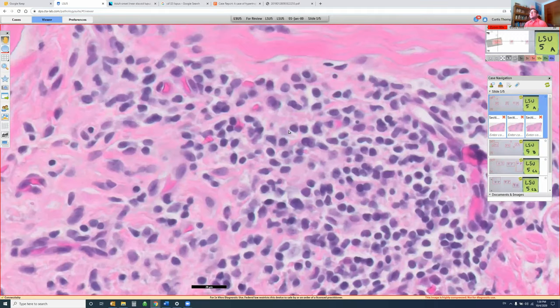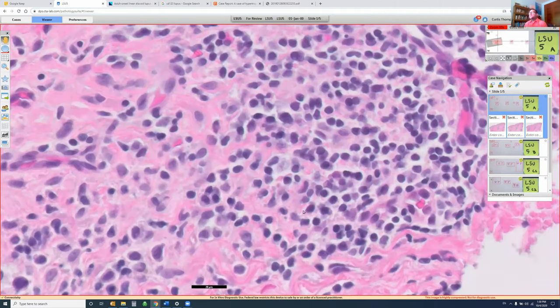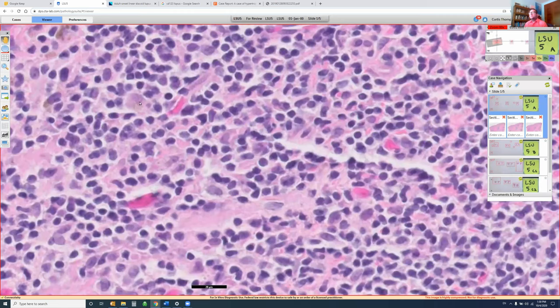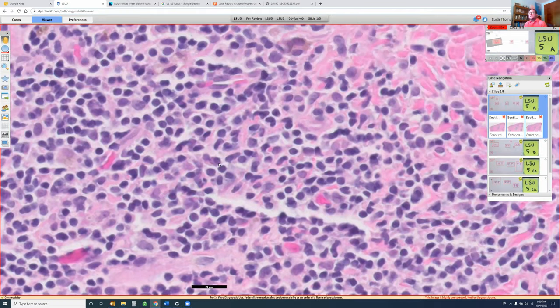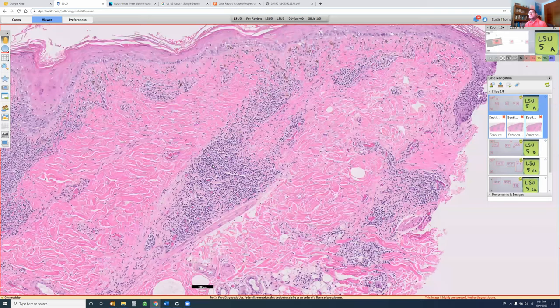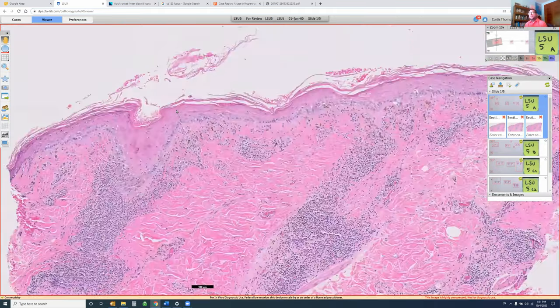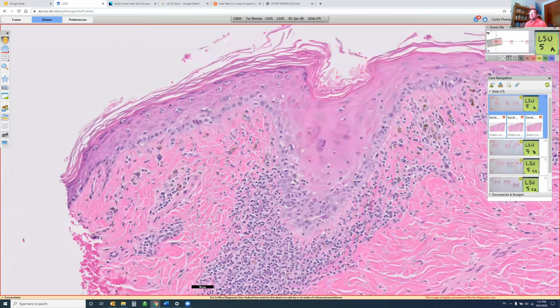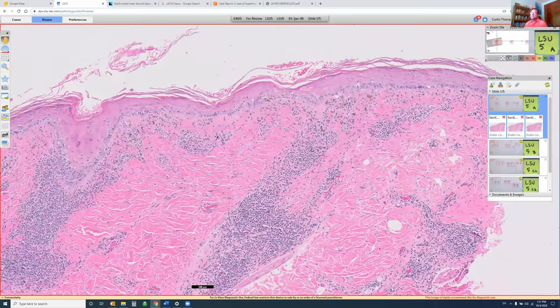You can find plasma cells in this infiltrate — we look for the little clock-face nuclei. There's one: eccentric round nucleus, pink. These aren't the greatest clock-face nuclei we'd like to see, but that's definitely a plasma cell. Plasma cells are useful in lupus always. Now that syphilis has reemerged, you should always be on the lookout. This epidermal change isn't typical syphilis, but I recommend doing the immunostain or serologies if you see plasma cells and have any suspicion.